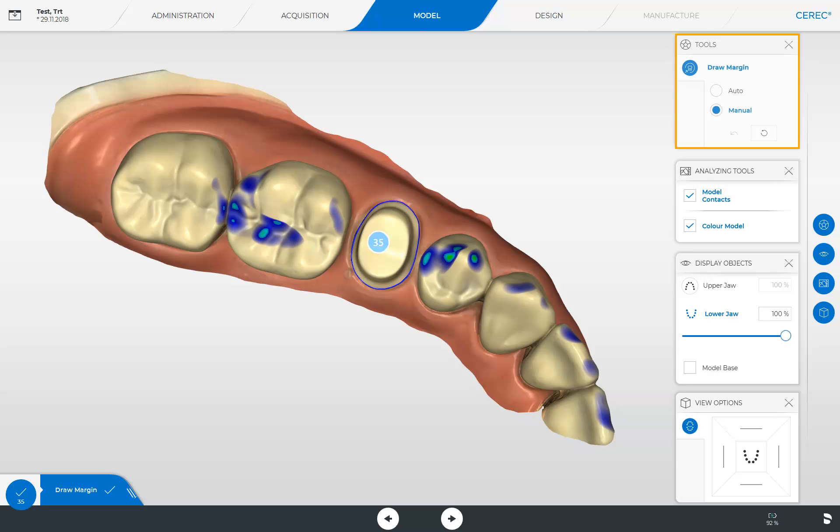Since we are currently in the step Draw Margin, only one tool is available to us, which allows us to choose between drawing the margin automatically or manually. Depending on the step that you are currently in, another tool or more tools will be available to you.